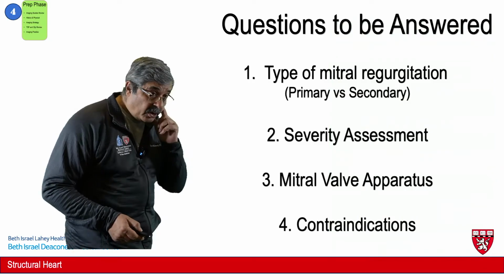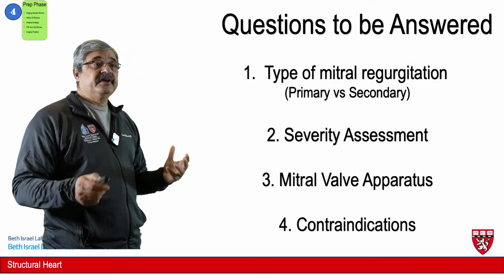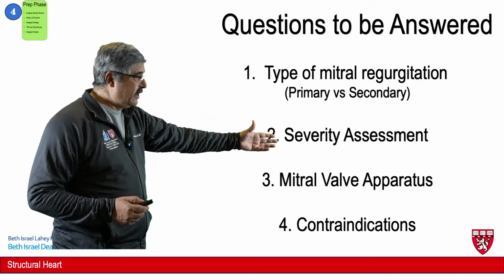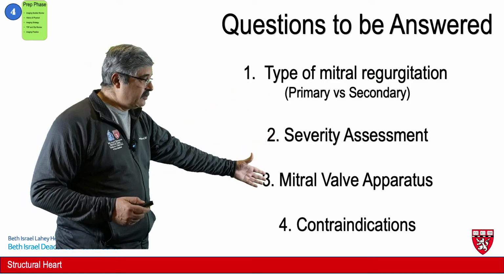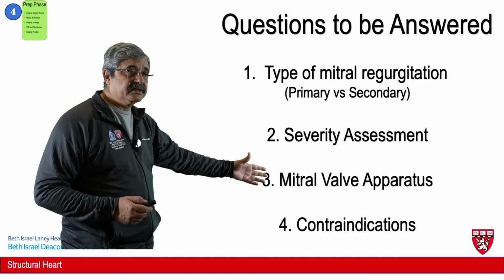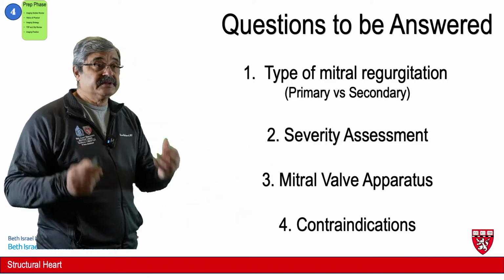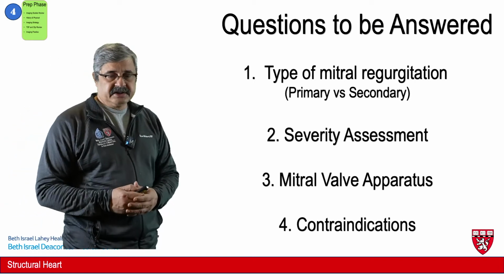So the questions to be answered in this prep phase are: type of mitral regurgitation, is it primary or is it secondary? Severity assessment, the status of the mitral valve apparatus, that's detailed knowledge and a complete science in its own right. And finally, any contraindications, more specifically, the presence of mitral stenosis has to be excluded.